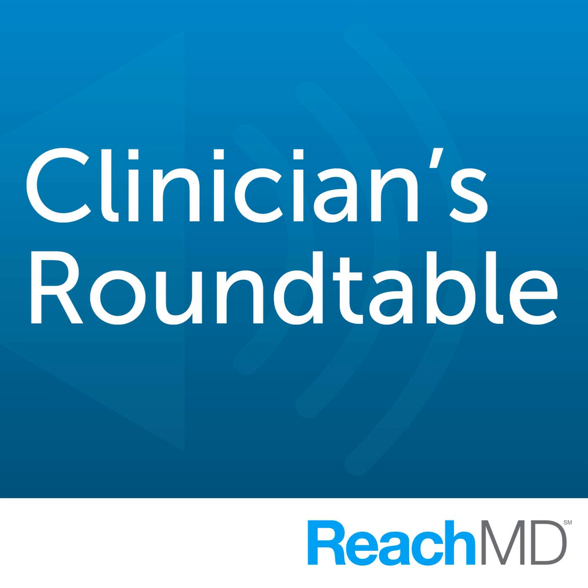What other advances in airway management may our listeners not know about? You mentioned that video laryngoscopy isn't common every place. What else? Right. I think that, honestly, most of the advances are on the technology front. There are more than video laryngoscopes out there. There's a whole host of video-assisted devices of all shapes, and also fiber optic and what we call optical stylets, which also aid in managing difficult airways. But most of it is on the technology front.